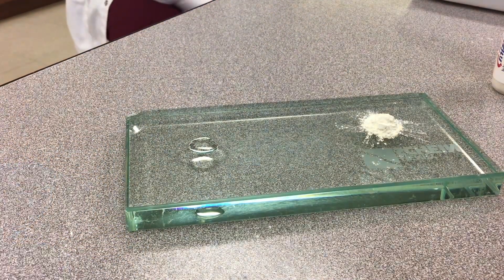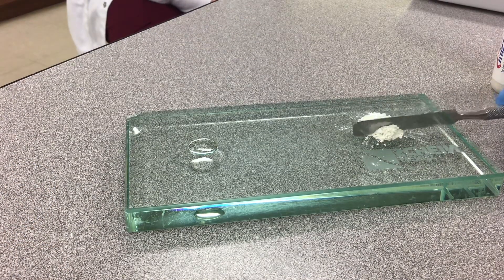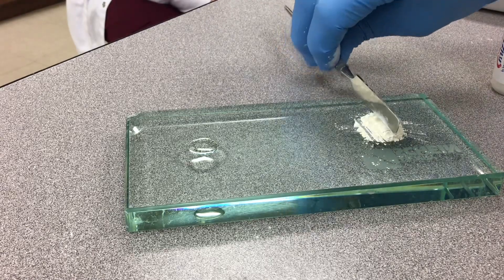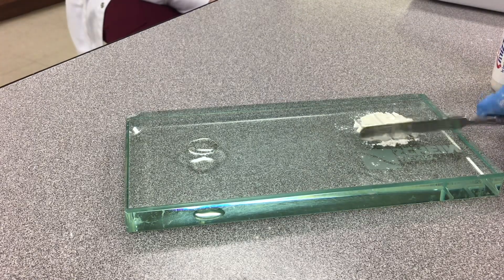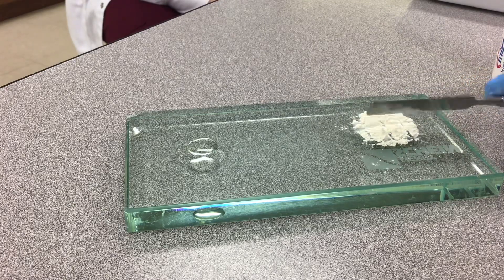And then with this material, it has to be on a cool slab, which we have here. You cut it up and then cut it up again in equal little lengths. You shouldn't be putting more than a little square at a time because this thing is a little bit different to mix.